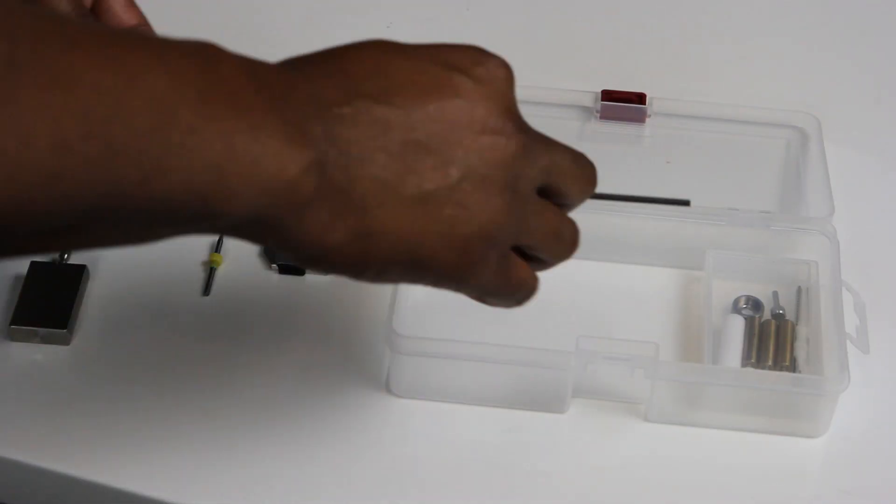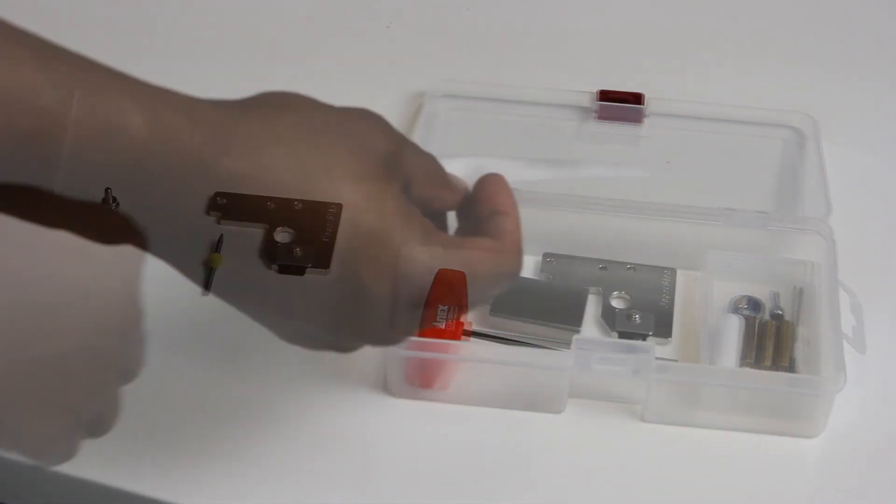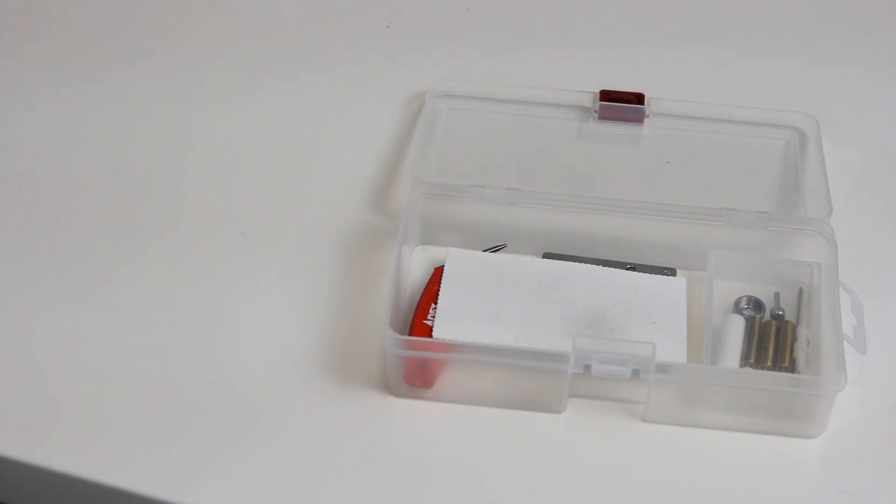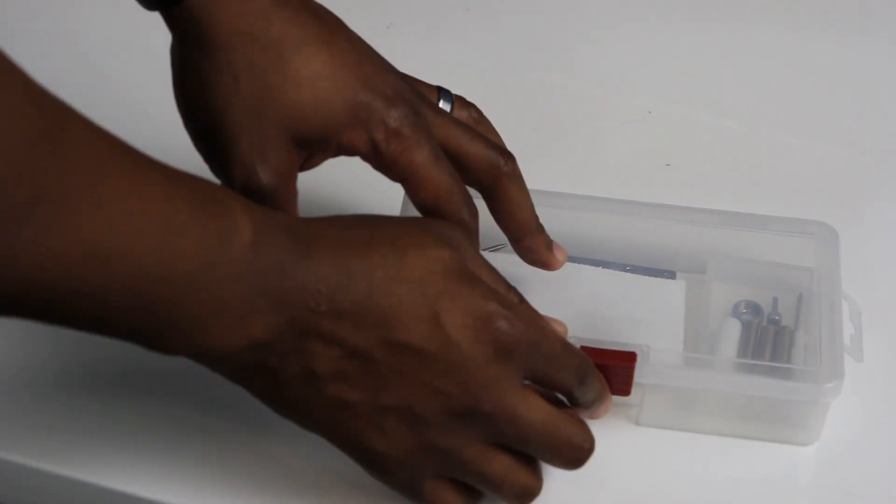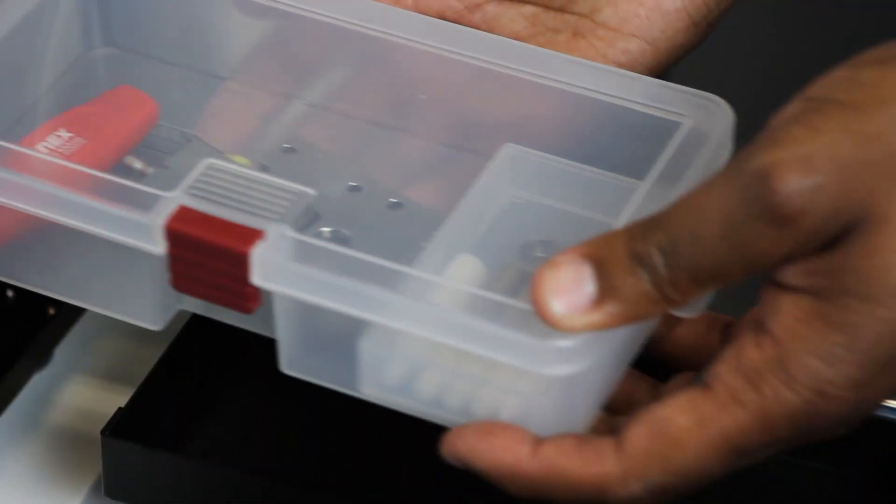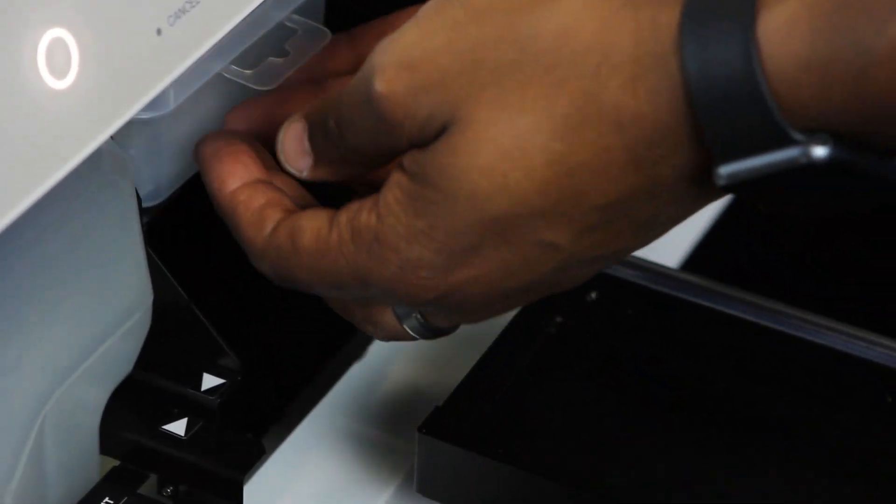After you have successfully removed the automatic correction accessories from your DWX mill, place them in the large storage case and place the large storage case back on the shelf in the bottom cover.